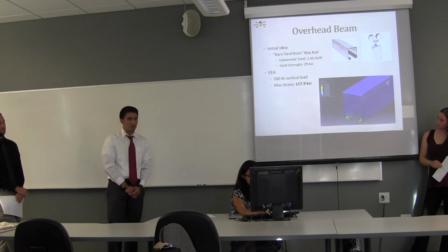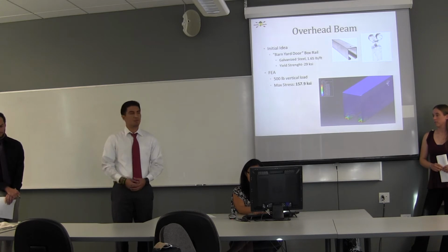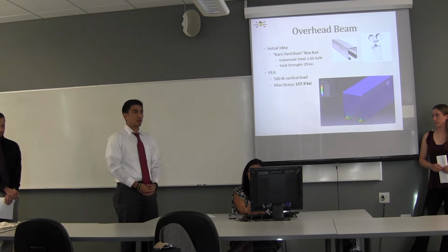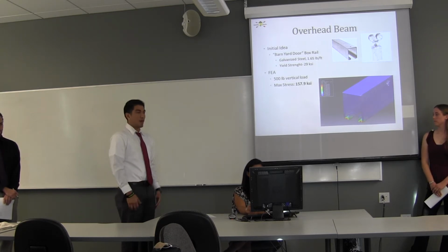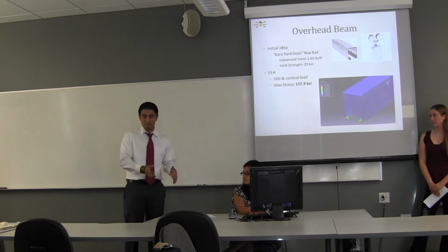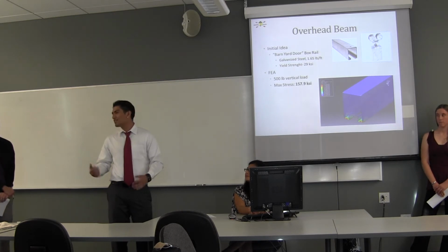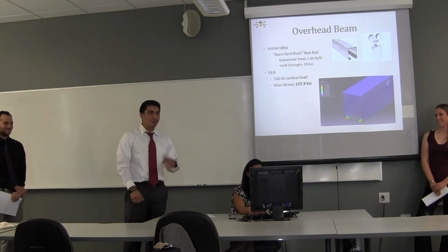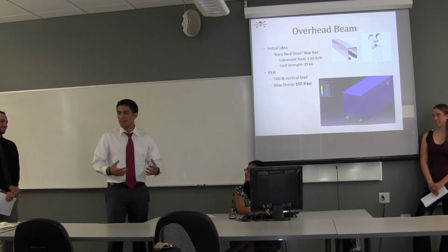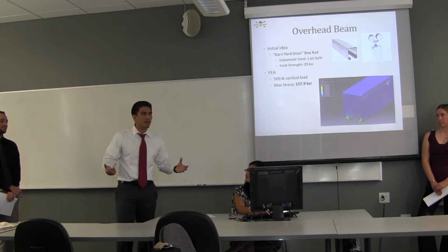All right, so now that you've seen our final design, we're going to go ahead and walk you through each one of our components. So first and foremost, obviously one of the most critical components is the overhead beam. At first, we were a little stumped, how are we going to get this person with a disability from point A to point B. And it just so happened that one day we were walking down the halls of 192, and we looked to our left, and I don't know if you guys have noticed, but there are these message boards that hang on what are called box rails. And we're like, hey, why not try something like that for our design?